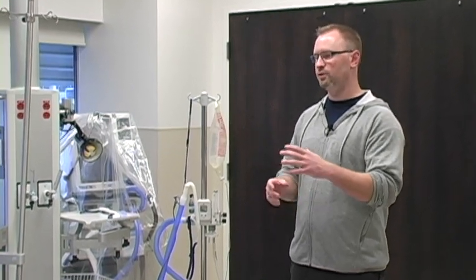The other thing with those high flows, not only meeting the inspiratory demands of the patient, but we're also helping them facilitate bigger breaths. So as their breaths get bigger, the respiratory rate will come down and their work of breathing will come down. It makes it easier for them to breathe. So a lot of times you'll see a patient who's tachypnic and you'll put them on the Optiflow and they start to settle relatively quickly. Their rate will come down, their breath just seems easy. It seems to facilitate a slower breathing pattern.